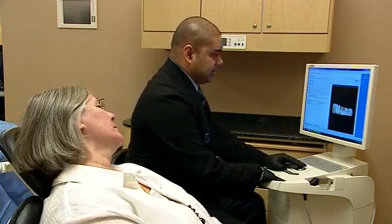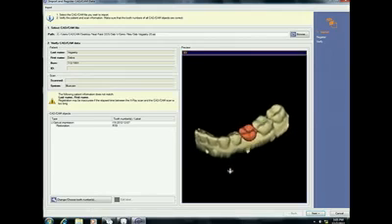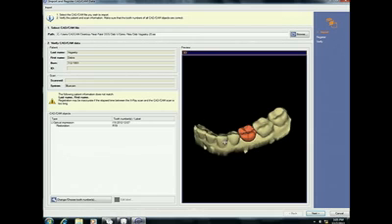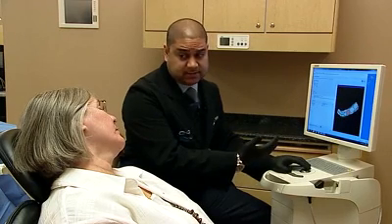And this is the tooth that I envisioned for site number 20. Now for the rest of the audience, as I'm doing this, I'm actually having my consultation with Deb in the chair. So I'm going to show you real time what the discussion is while I'm treatment planning this patient. So we'll pretend like this is actually happening in my practice. So this is the tooth that I think is best going to fit that space, Deb, that you have.